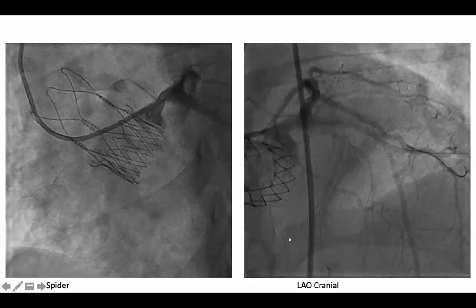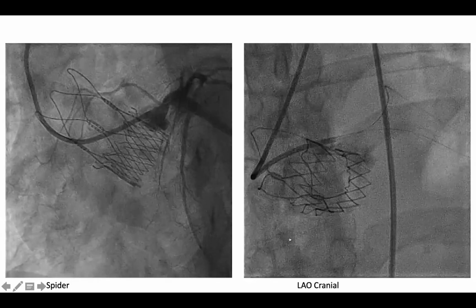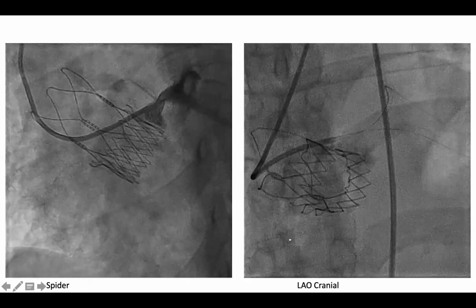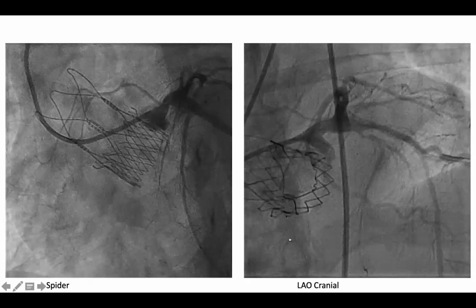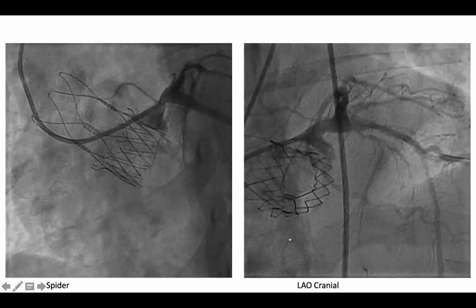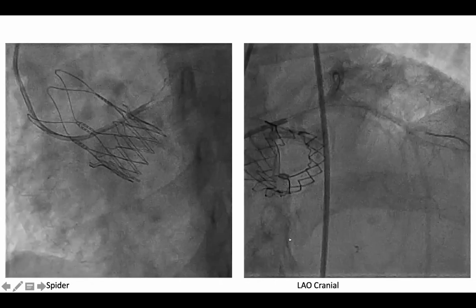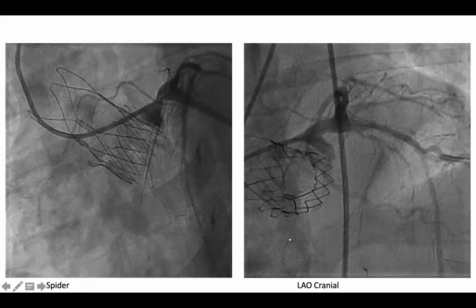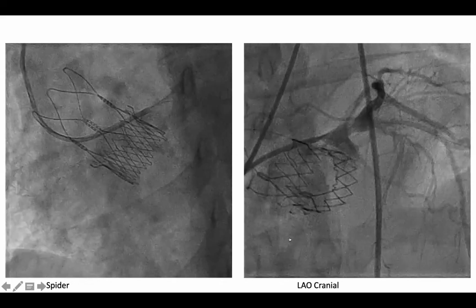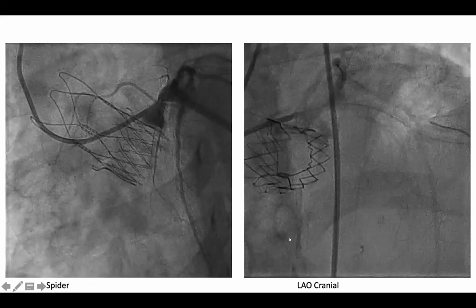Sometimes, everyone might have seen these patients in which the left system is occluded and the patient is surviving from collaterals from the right coronary artery. In these patients, you would go in thinking that it's left main stem disease, but the LAD is already occluded from before, and it's the right coronary artery which has led to cardiogenic shock. So having a look at a contralateral artery is always a good idea.